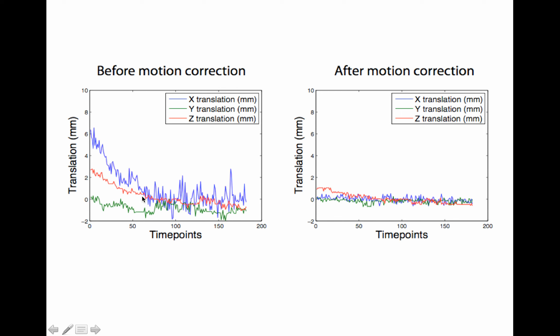You might be wondering why these all dip down through zero in the middle. The reason is that this is the middle TR that was used as the reference — obviously the reference doesn't need to be registered. Also, importantly, the images close to it in time, just before or just after, don't need to be moved much to match up with it. It's the ones that are further away in time that need to be moved more.